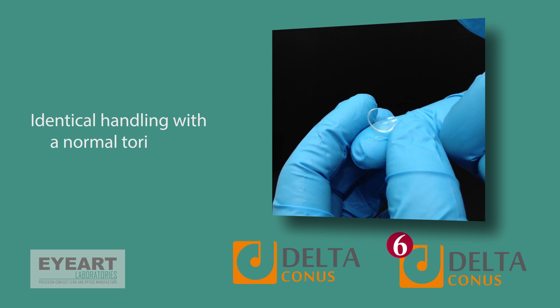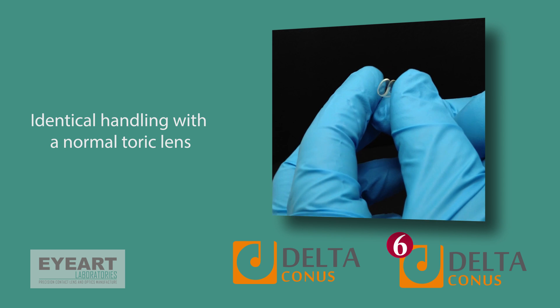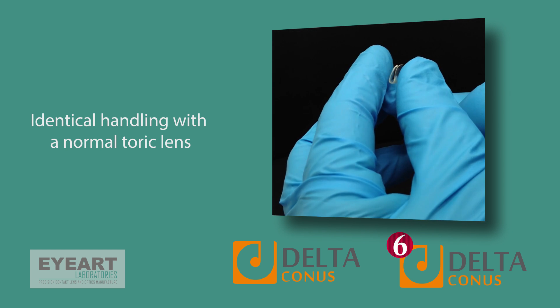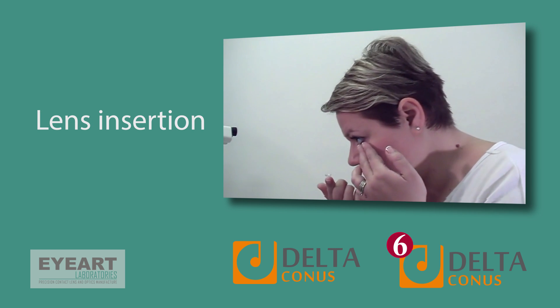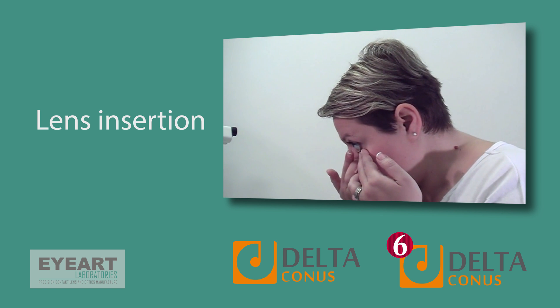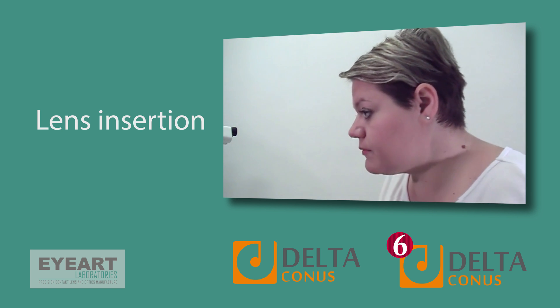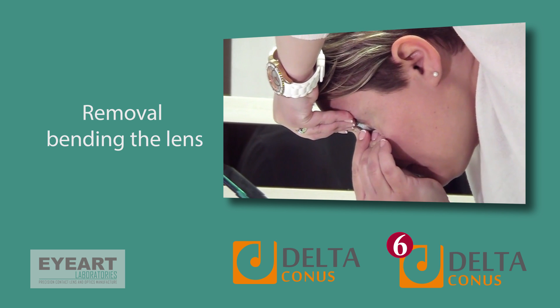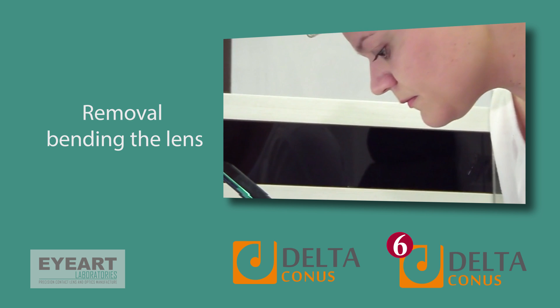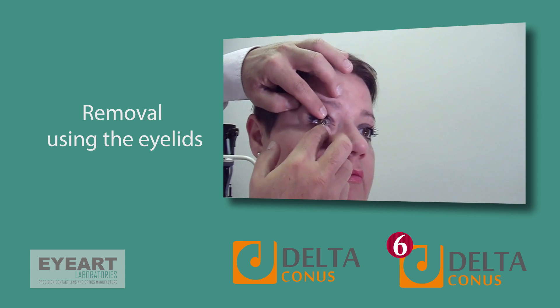The handling of Delta Conus is identical to a normal lathe-cut soft toric lens, with some extra volume. Lens insertion is performed in the usual way, with the patient's head leaning forward to avoid lens drop while reaching the eye. Lens removal is done in two ways: dislocating the lens from the cornea and then bending it away from the eye, or bending the lens using the eyelid borders.